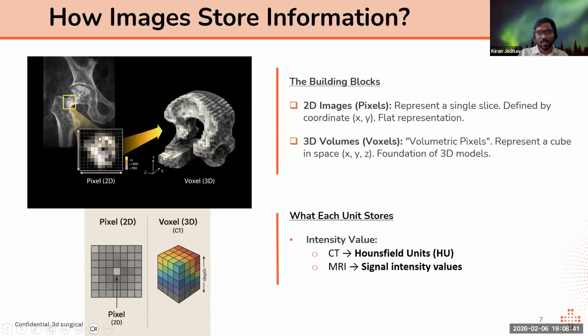This represents the bone region. Depending on the absorption of photons, whenever the scan is happening, the scanner emits photons upon the body, and the body reacts according to the absorption rate. The attenuation factor that we get automatically gives us these values.